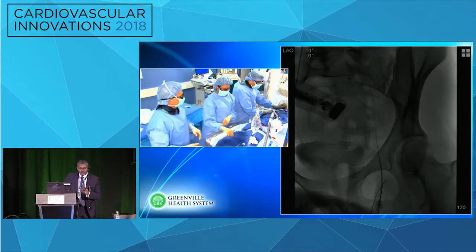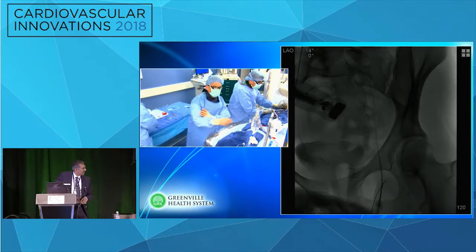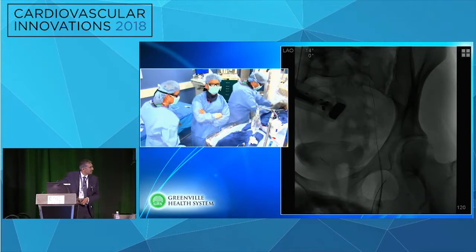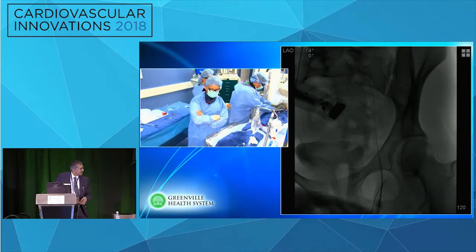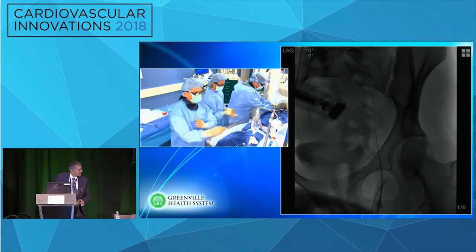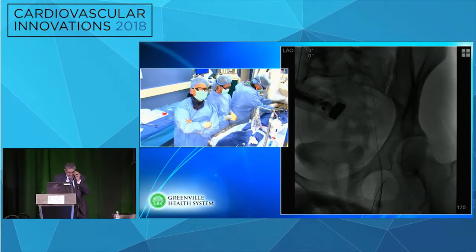Bruce, while you get access, I'm going to ask the panel, why wasn't the previous time the lesion stented? Is there a thought? Steve, any thoughts? If you would have done it, would you have stented it? Well, I think that's probably the reason this may be more of a heartache, because that could have been prevented with a stent. You just know it's going to be a return trip. Yeah, that wasn't my decision that it wasn't stented.